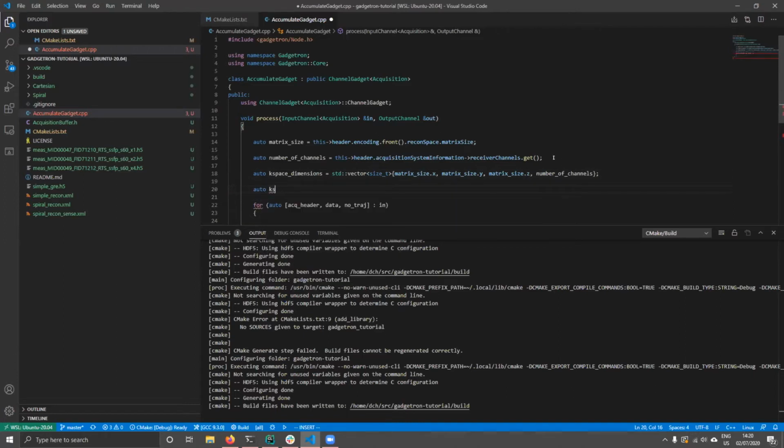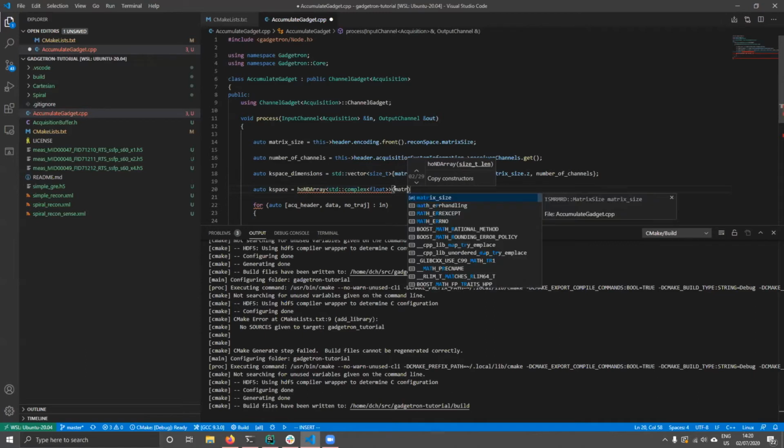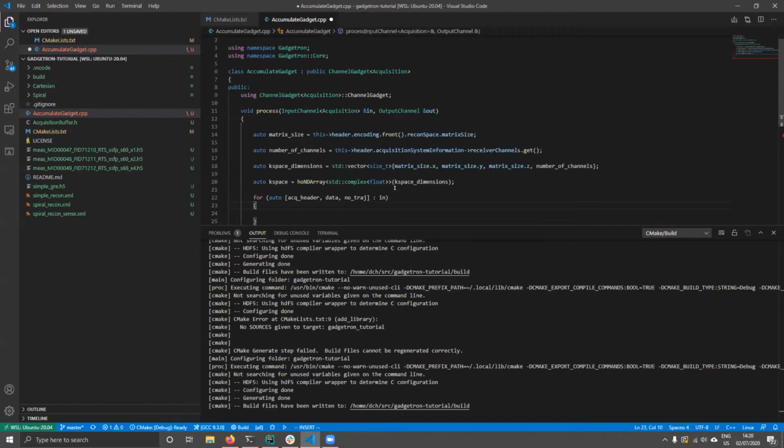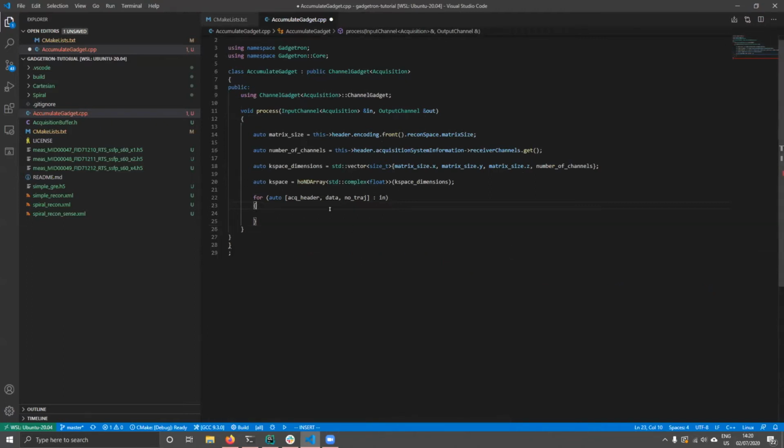We forgot the most important bit. We spent a lot of time creating these kspace dimensions, and then we completely failed to use them. So the HoNDArray that we are instantiating here, that's like the basic array type in Gadgetron. It's like the ndarray in Python, or like the matrix in MATLAB. It's a multidimensional array. In this case, we're making one filled with complex floats, and we want it to have kspace dimensions. And let's get rid of that.